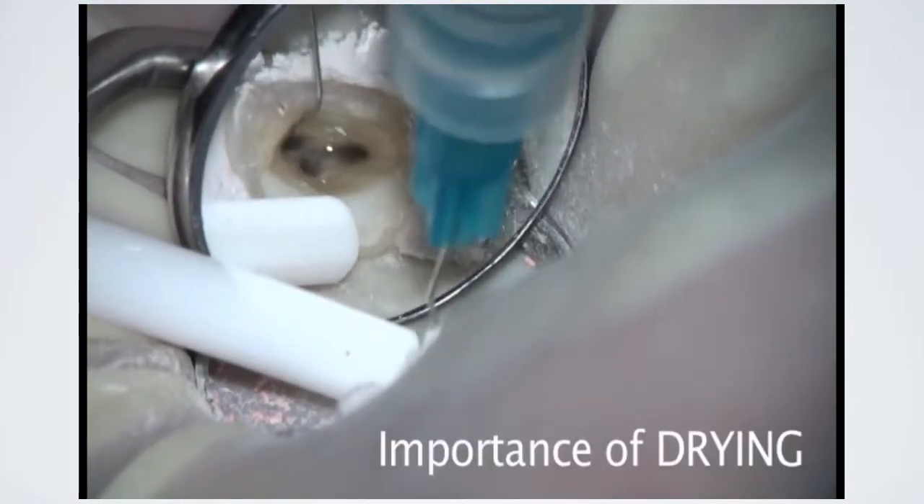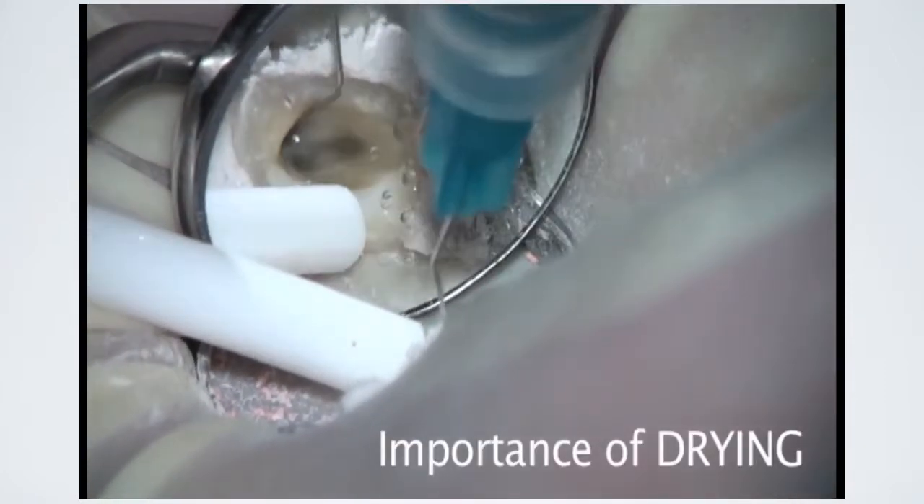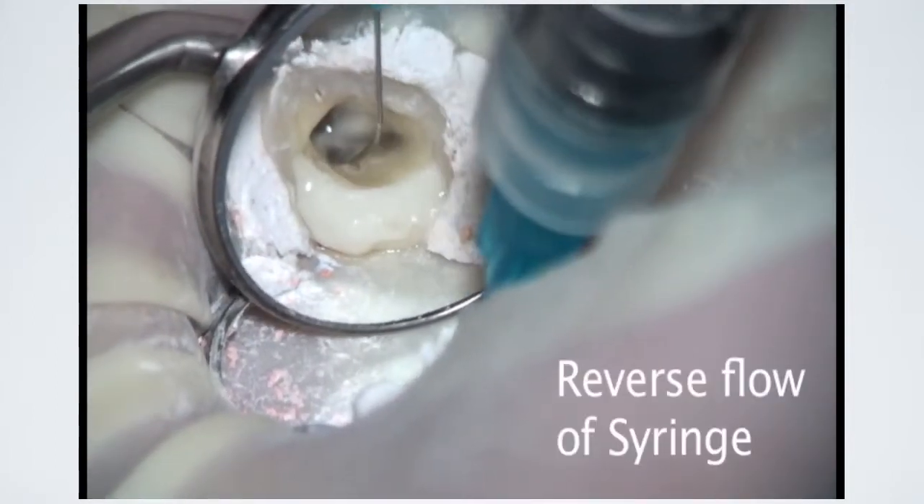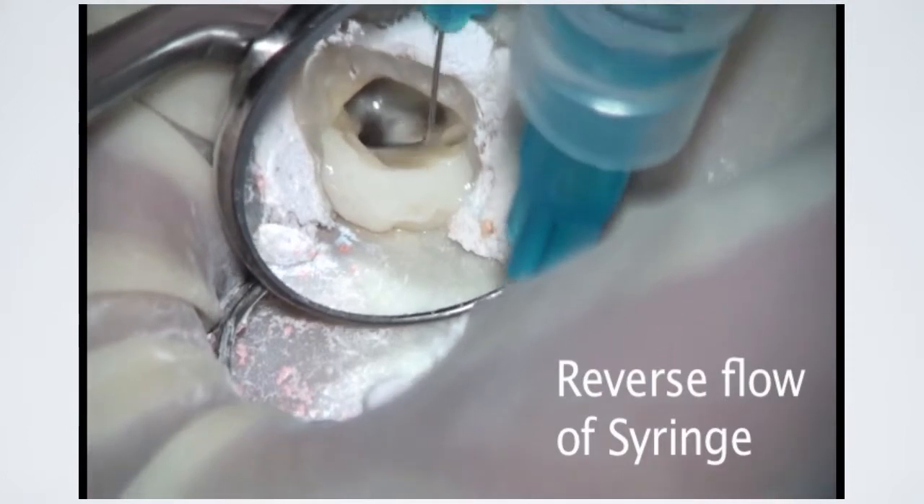The final irrigation protocol concludes with a final rinse of isopropyl alcohol. Due to its high evaporation rate, isopropyl alcohol decreases the number of paper points required to dry the canal.